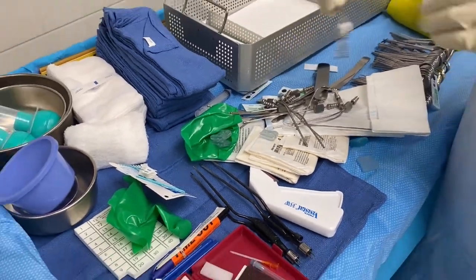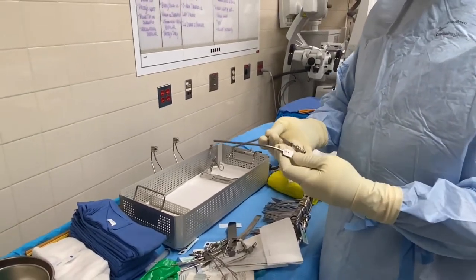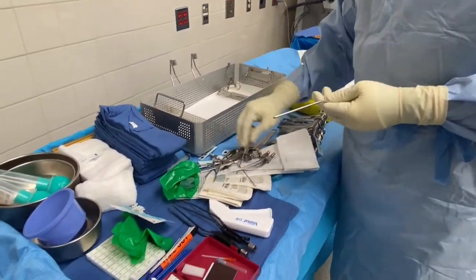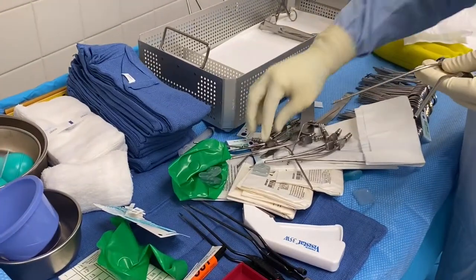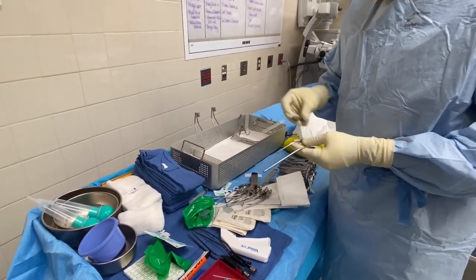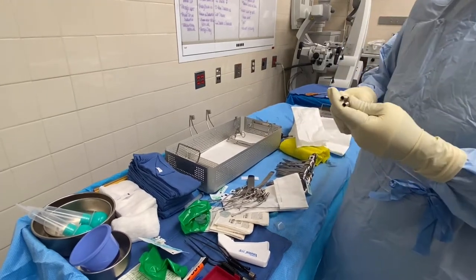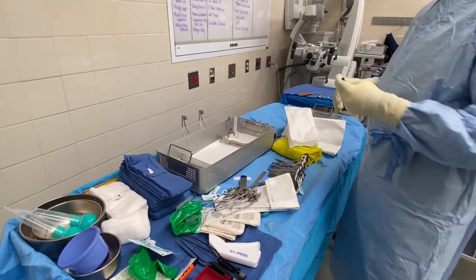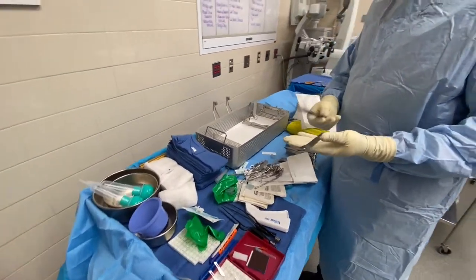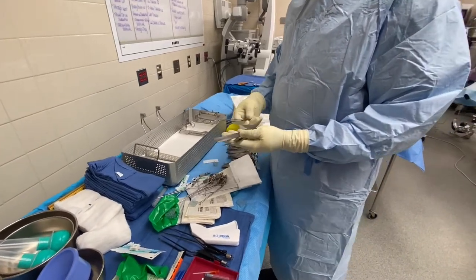The most important thing in neurosurgery is going to be suction. These are Frazier suction tips — this is a 12 French, and we're going to start with a 12 and a 10. This is a 10 French; sometimes the doctor wants a smaller version. We'll lay them right here.